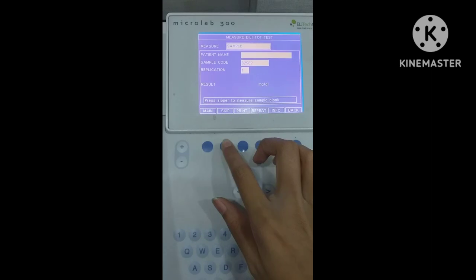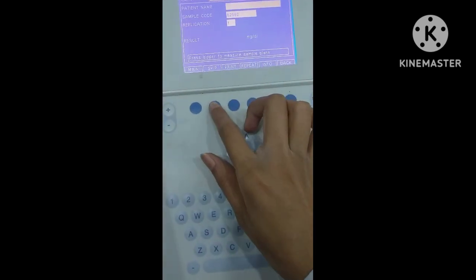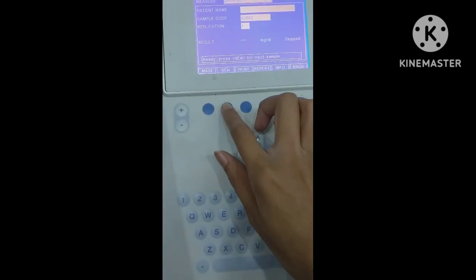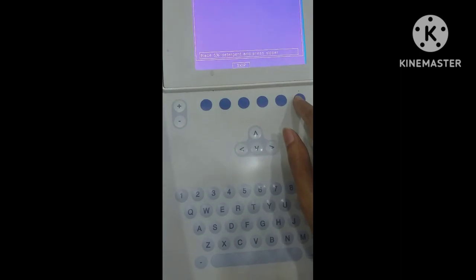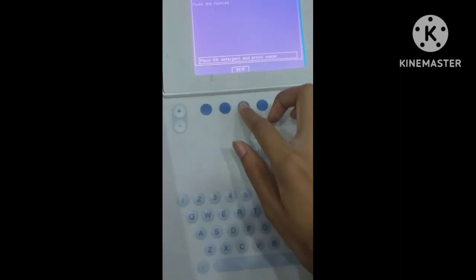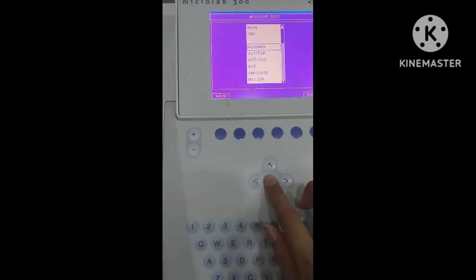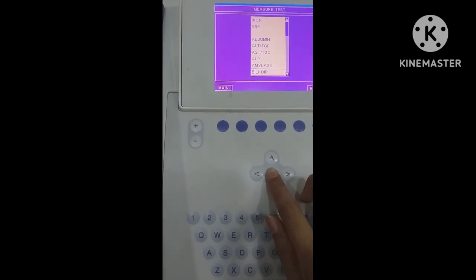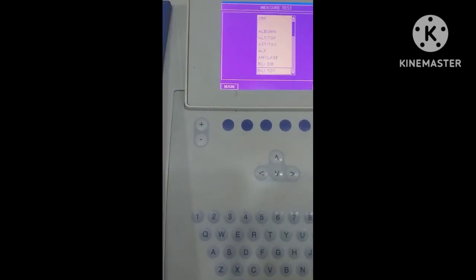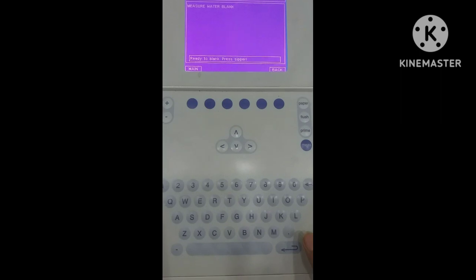Now we will select the parameter of total bilirubin in our machine. First, clear all the previous tests and press the 3rd button. Press the down button and select bilirubin total, then press OK.